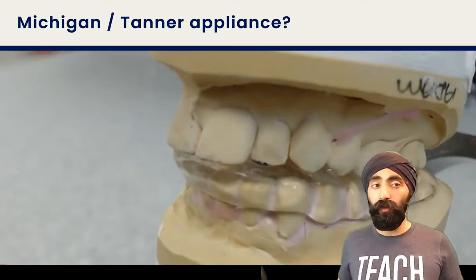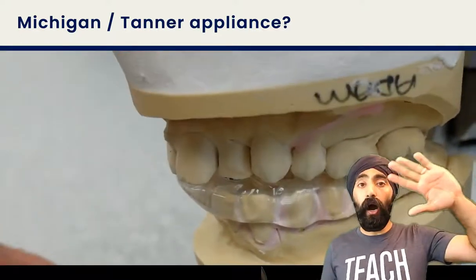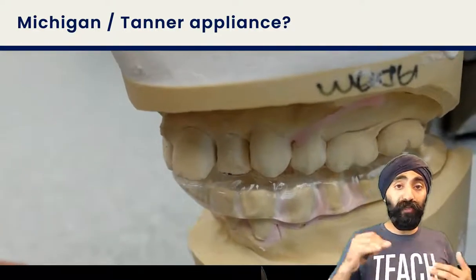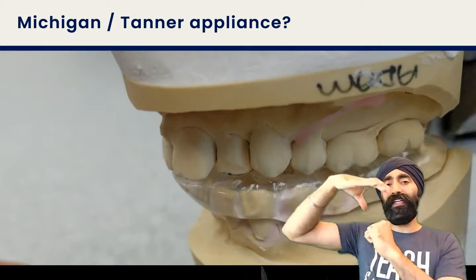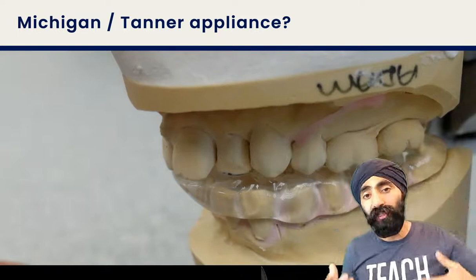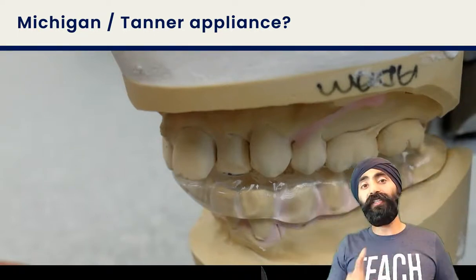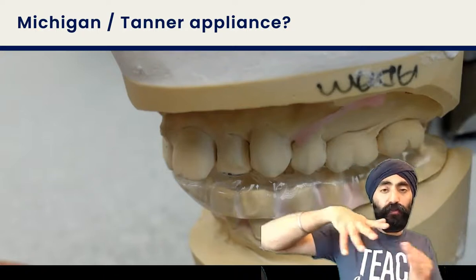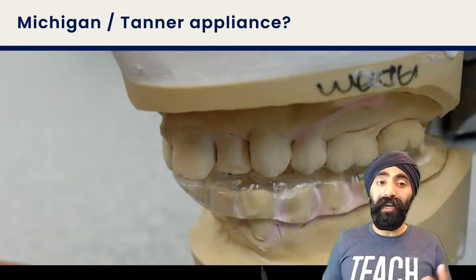We can give them anterior guidance with a Michigan or a Tanner splint. Remember, I said Michigan is an upper hard occlusal splint. The lower one is called a Tanner splint, okay? So the condyle is in a snug position in the articular eminence, so centric relation or stable condylar position. When the patient bites together, they have equal intensity contacts. And then as soon as the patient grinds or excurses, there'll be anterior guidance. So these appliances work in that manner.